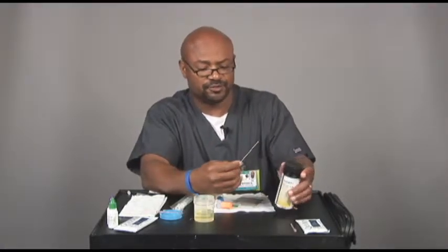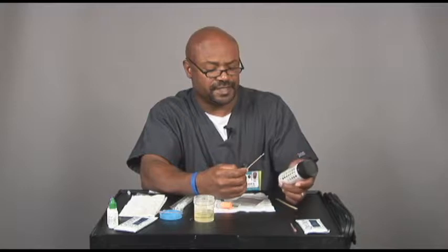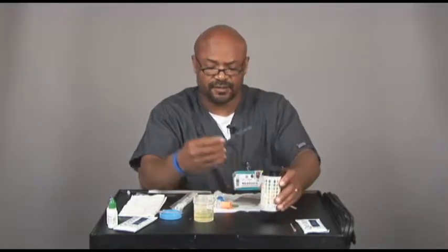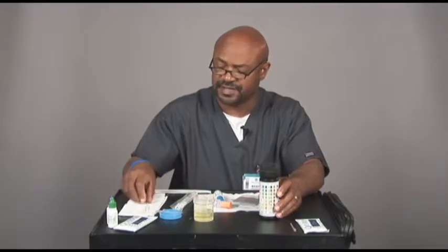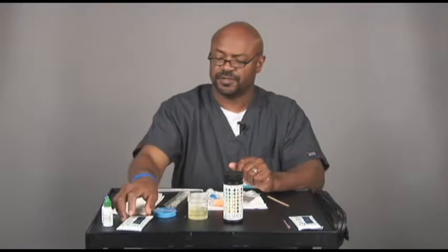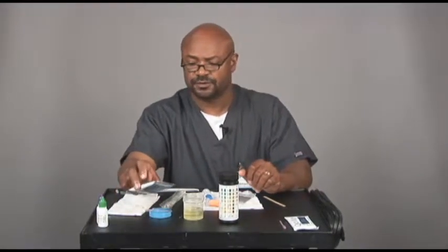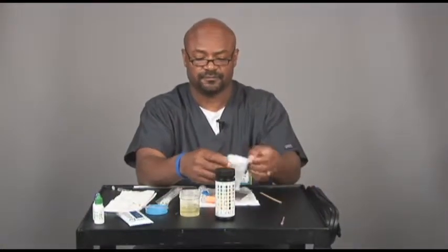So that is the urine multi-sticks. That is one of the tests that we perform quite often in the emergency department. And the main one, like I said, is the urine glucose, which, again, I reiterate, it takes 2 minutes for those results to completely result out.